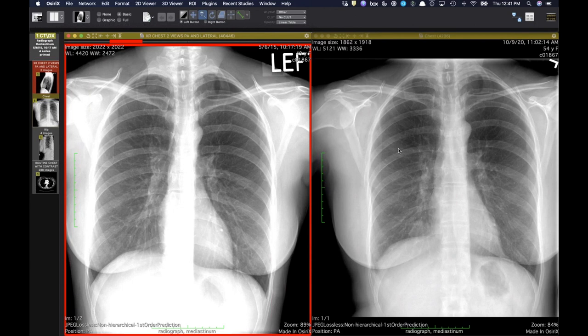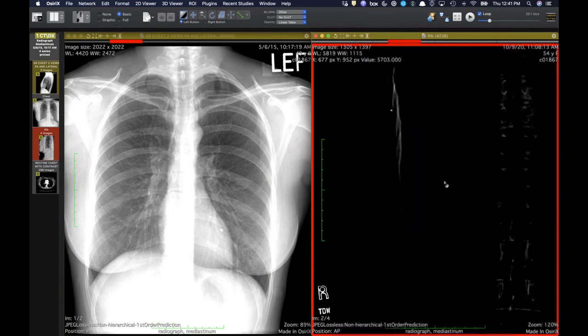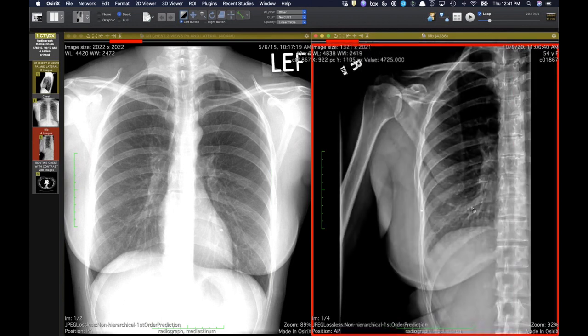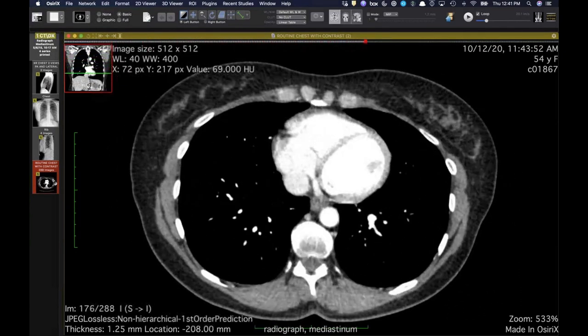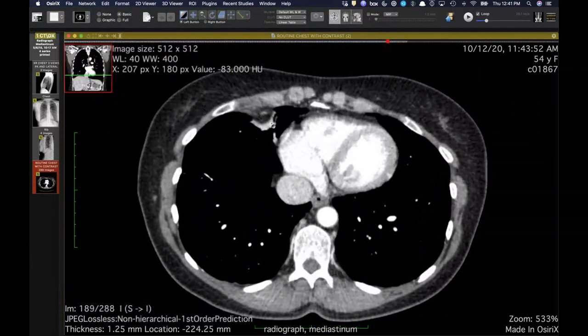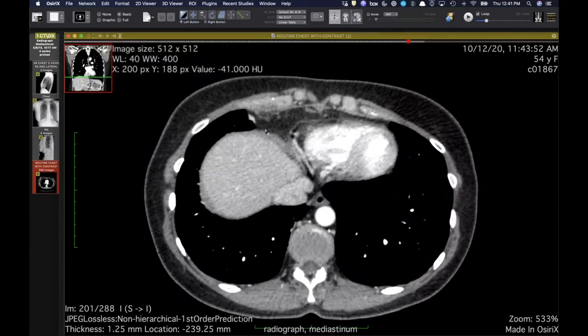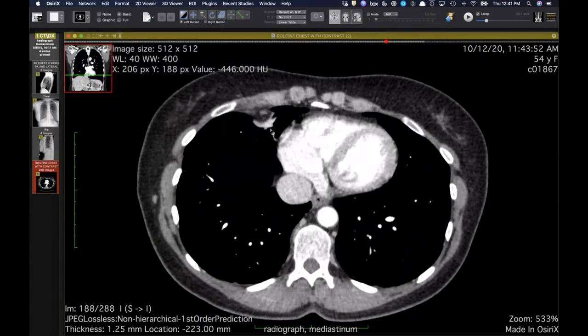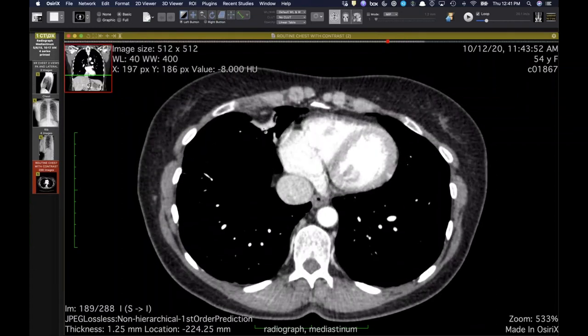And on one of these oblique rib radiographs, it persisted too, or a little bit, right in here. He was wondering if this was the same thing. That turns out to be close to where the pain is. You can see the rib markers a little bit more lateral. She underwent CT to further evaluate whether there was a lung mass or something, but it turned out to be here. We've shown lots of cases of mediastinal fat necrosis. This one is a little atypical because it's more anterior in location, and rather than being right along the pericardium, it's more along the anterior pleural surface. But I think that's what this is.